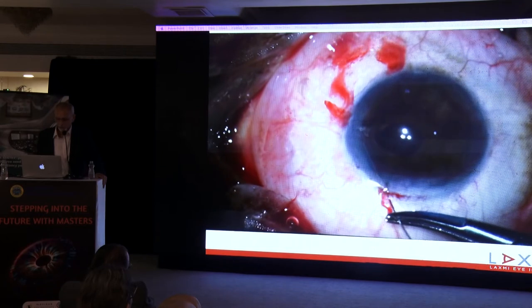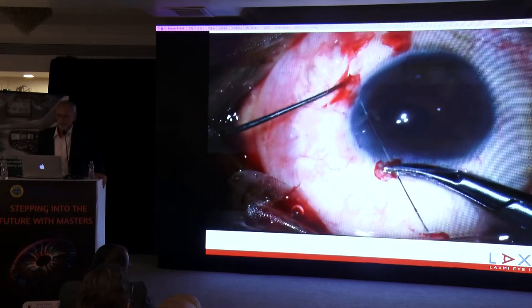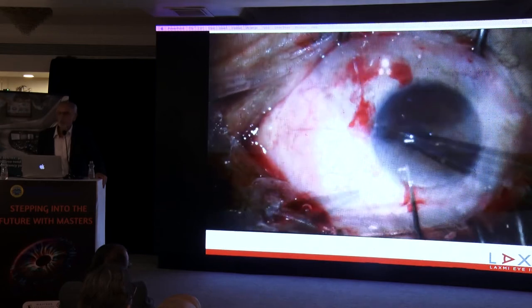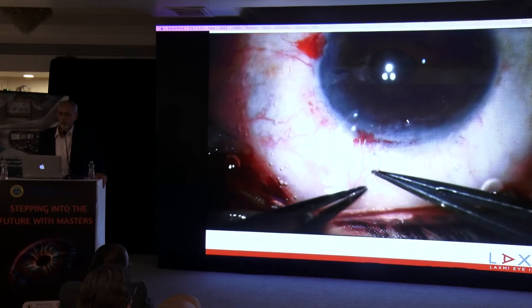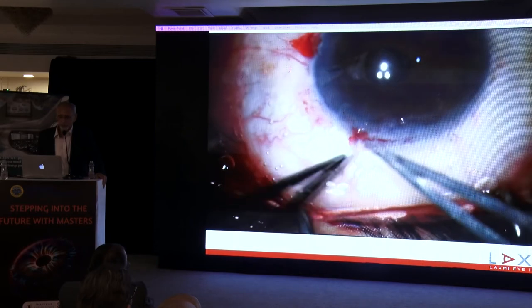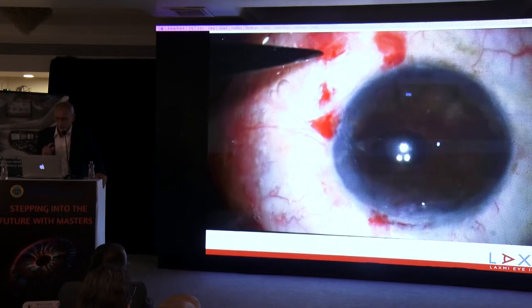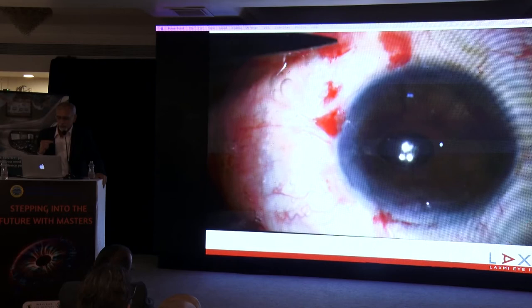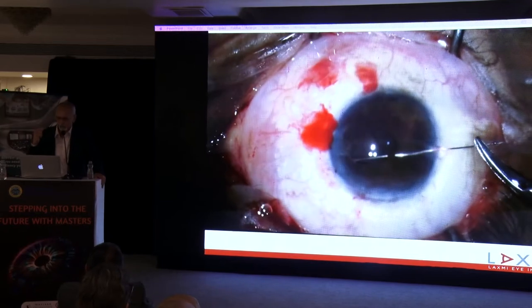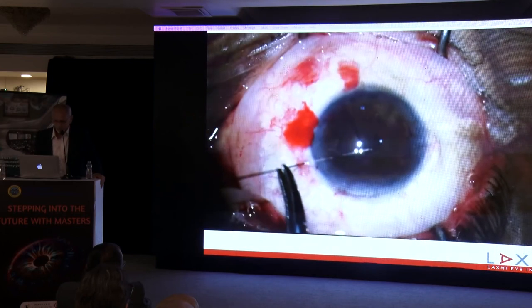So as to take care of that, first I try and cover that defect, because that defect can be nasty. That you do by the same technique where single throw, single pass, four throw. And it's a beautiful technique, very simple to do. If you notice, I used one side port to go in, and the needle came out not through any side port, but it came out blindly. You don't need to have another side port there.